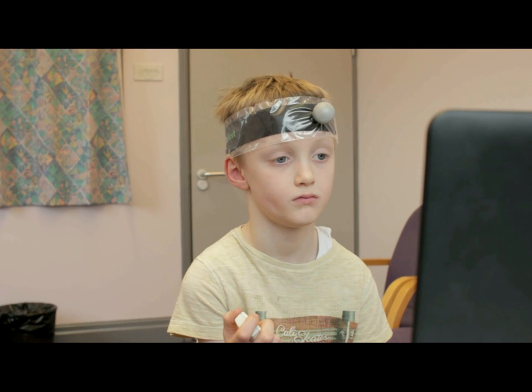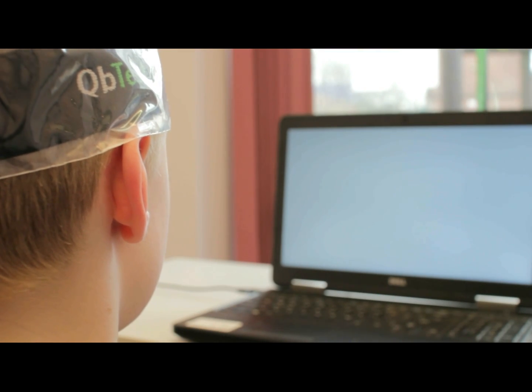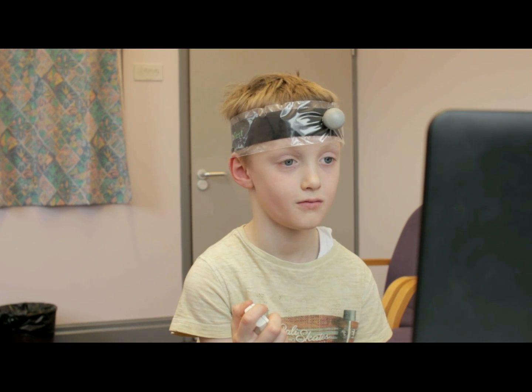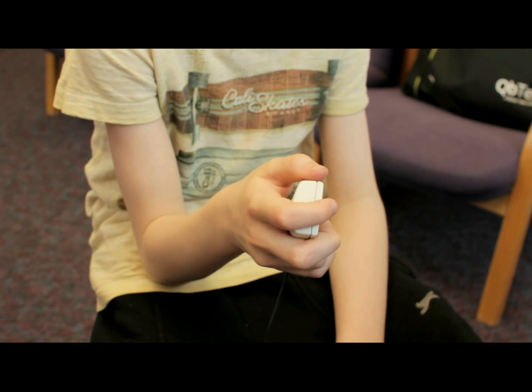Many of the children who do the test find it lots of fun. Is it like science? It is very scientific — it picks up your movements. What does it measure? The test measures your activity, your impulsivity and your attention while doing the test.